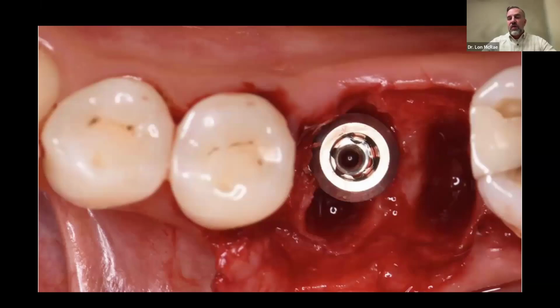When you're looking at a lower molar, which is the number one most replaced tooth by an implant, because of the curve of Spee, we want to be in the mesial root of that tooth. We can be right in the septal bone, that's fine, but we're not going to be as strong as if you were in the mesial root like what it's showing here. There are lots of opinions whether this is right or wrong. I think it's actually a very good spot to place this implant.